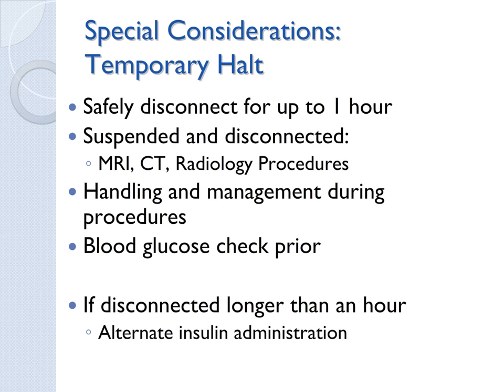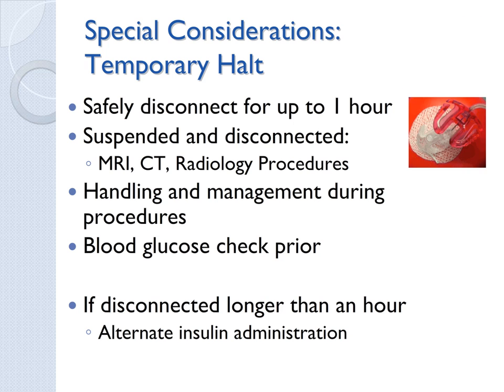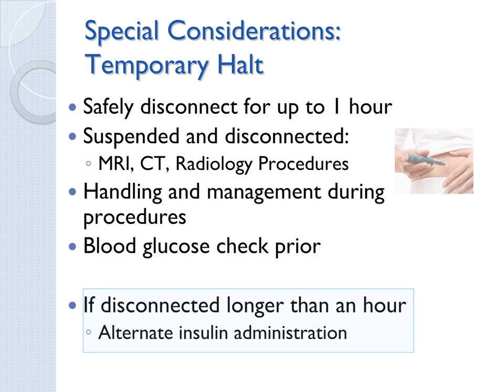On occasion, the insulin pump may need to temporarily be disconnected. The patient can generally do this at the site or the set for those pumps using tubing. For those with the patch pump, such as the Omnipod, they would need to actually remove the pod. This can be done safely for up to an hour. If the pump must be discontinued for more than an hour, the patient may require small boluses of rapid insulin that they would be able to calculate to replace their basal rate. Or for longer discontinuations, basal insulin would need to be started.